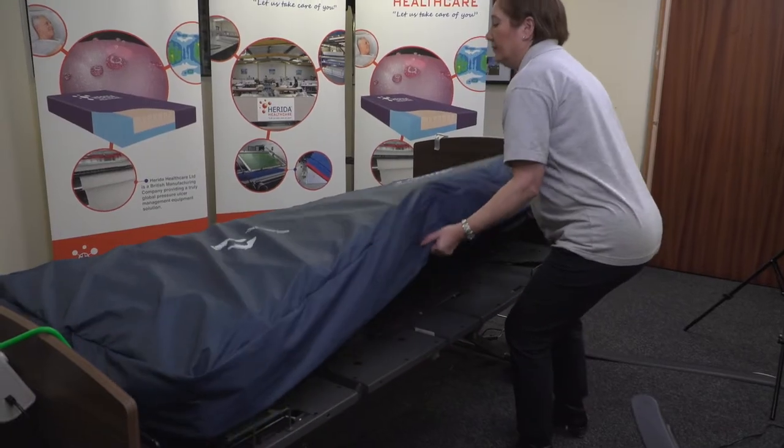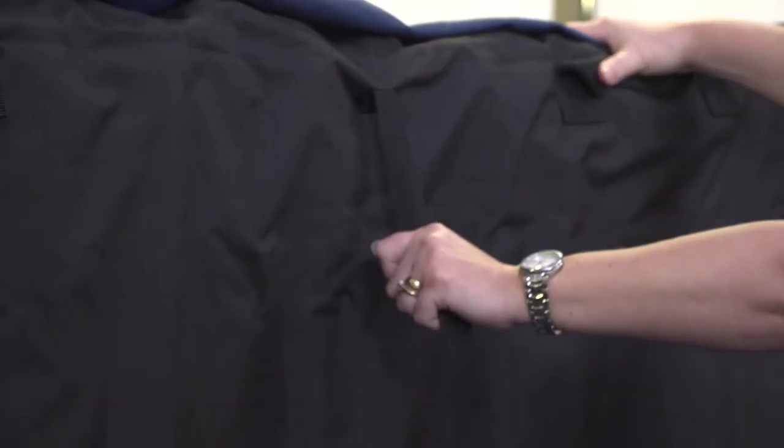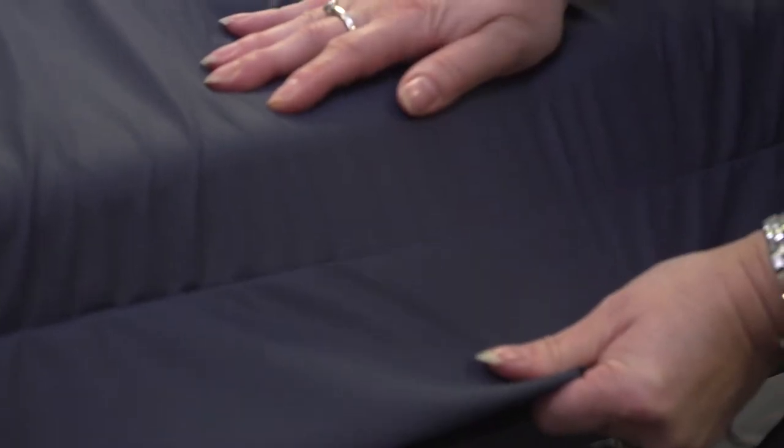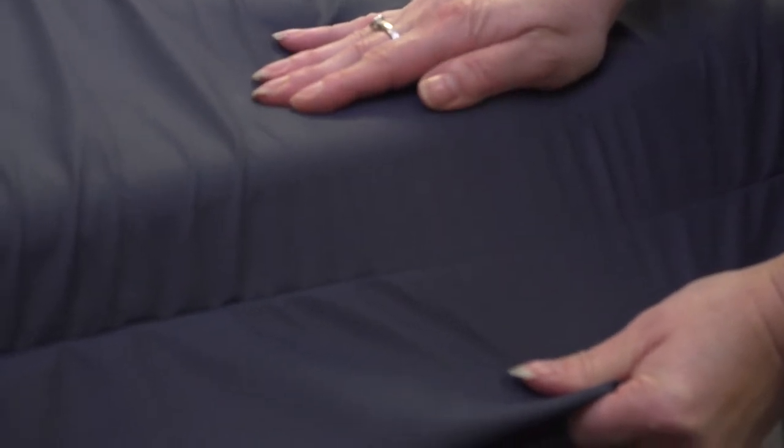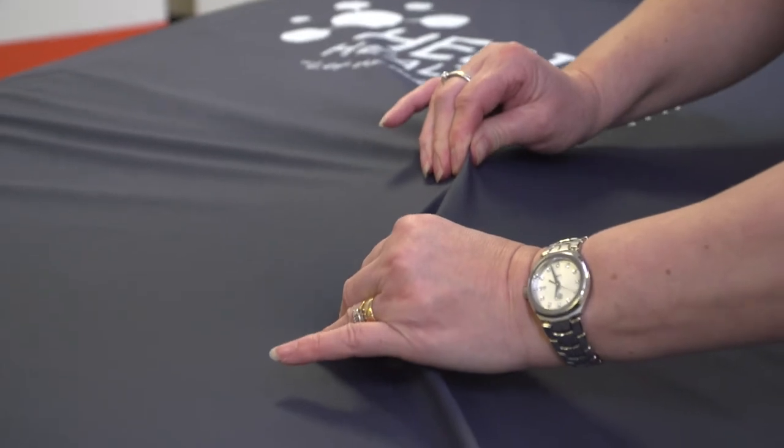The Herida Argyle II deep cell technology ensures that the highest level of care is achieved, including those patients with severe damage. This product has a toughened base and securing straps. The top cover is waterproof and has pulse welded seams to prevent fluid ingress. It is also vapour permeable, which allows a high moisture vapour transfer rate, thus maximising the airflow to patient skin surface, keeping skin dry and reducing susceptibility to tissue damage.